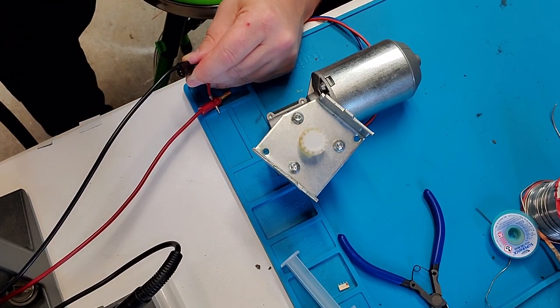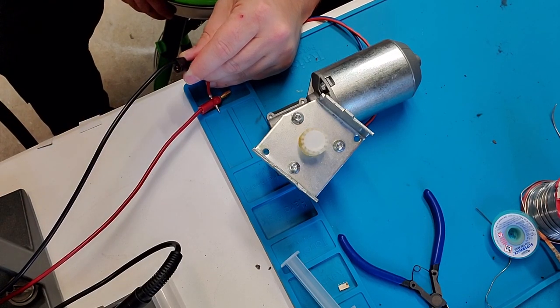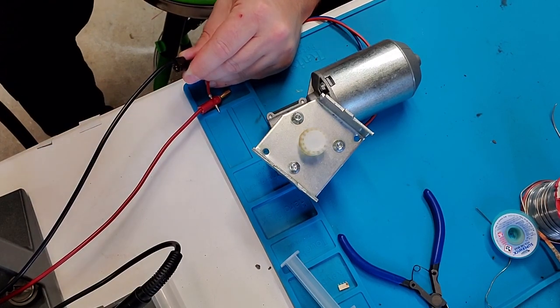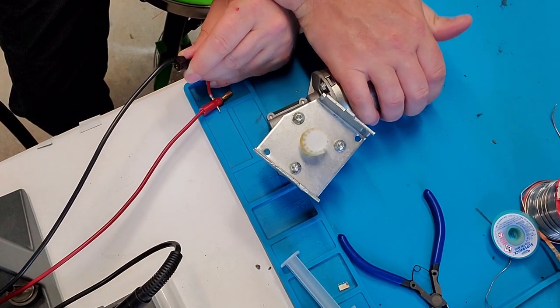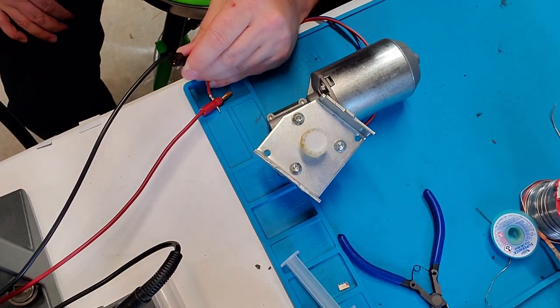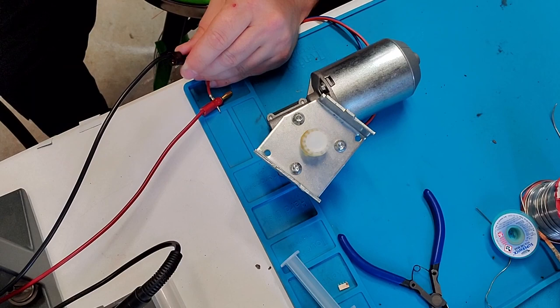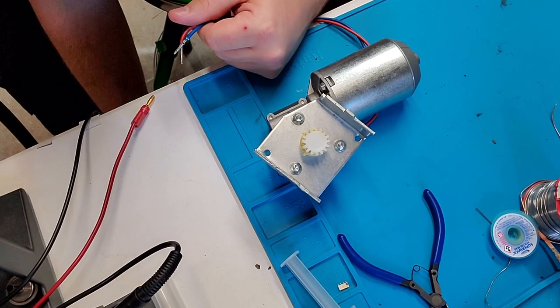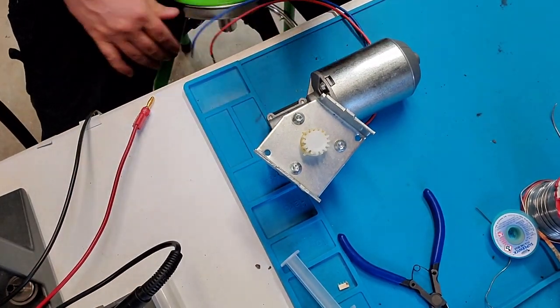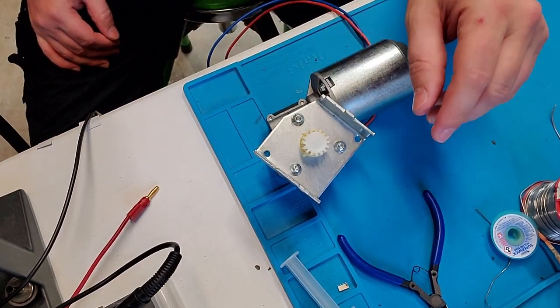So I'm at 23 volts, 24 volts. I'm sitting at 1.6 amps steady. 1.53 at 24 volts. So the amperage is not going up, the motor's not getting hot, and the transmission sounds perfect. Normally it would be clunky, and you'd hear maybe some of the nylon gears. I'm assuming there are nylon gears inside it. So that's one way of using a regulated DC power supply to troubleshoot.